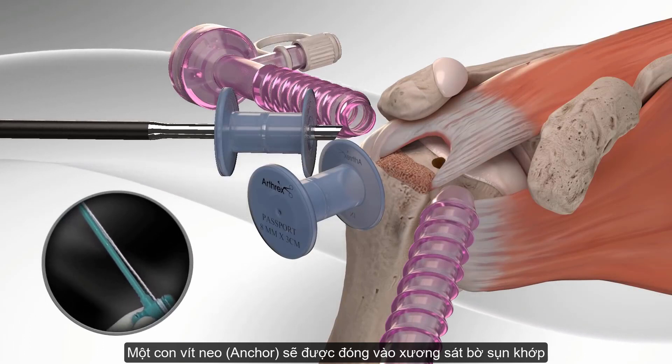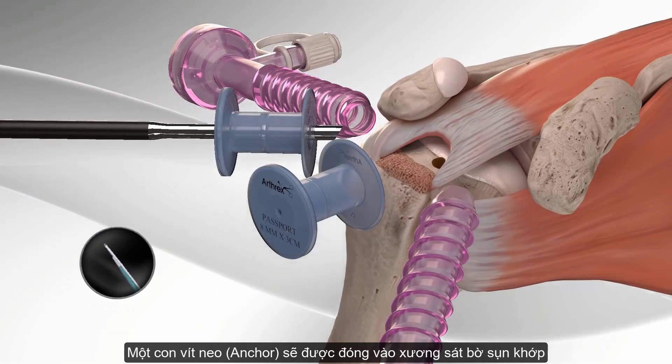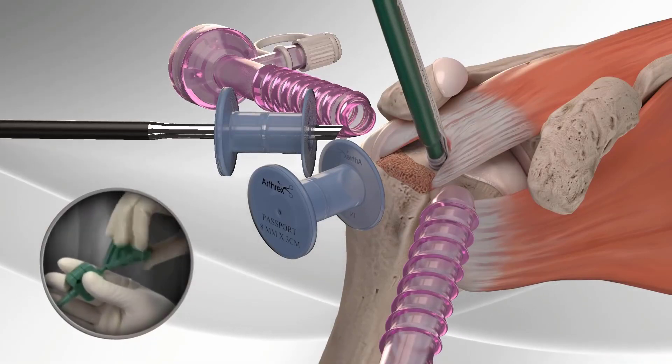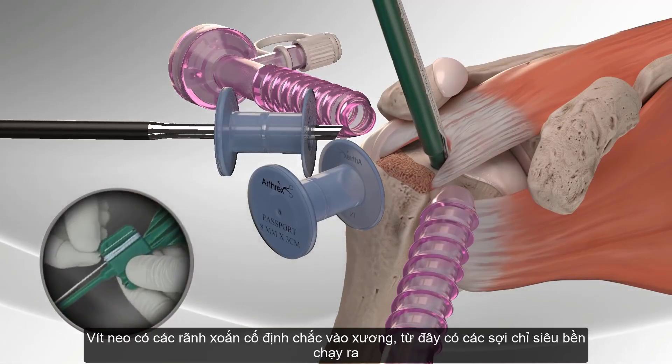The swivel lock is available with a ready-to-use fiber tape loop. The surgeon inserts the swivel lock anchor into the bone and releases the fiber tape loop.